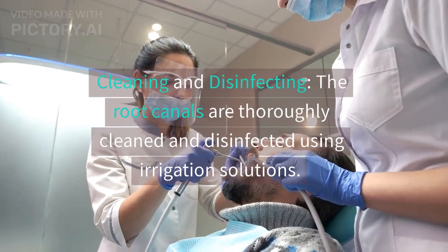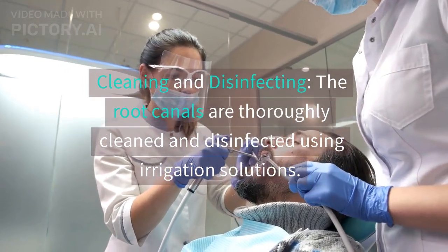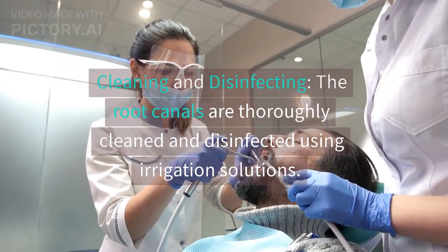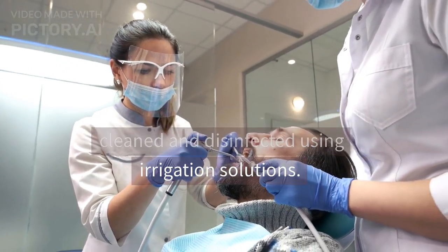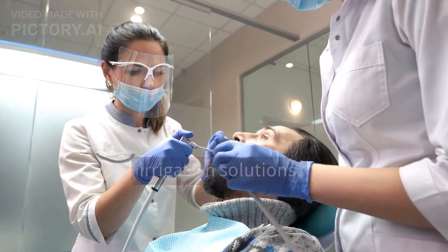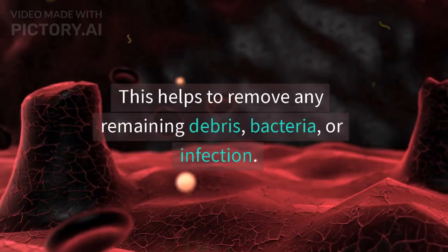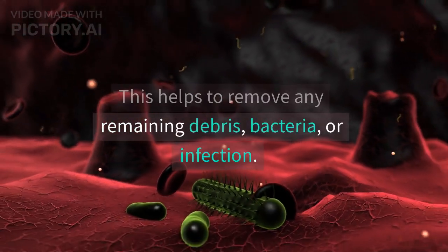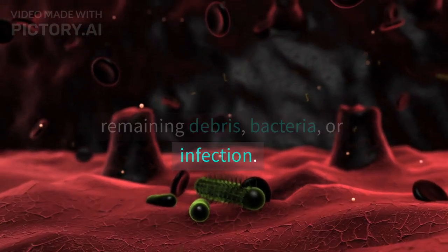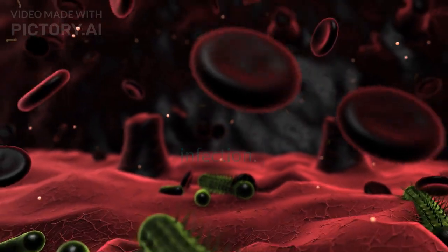Cleaning and disinfecting. The root canals are thoroughly cleaned and disinfected using irrigation solutions. This helps to remove any remaining debris, bacteria, or infection.